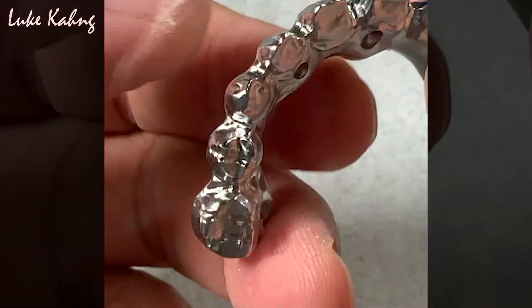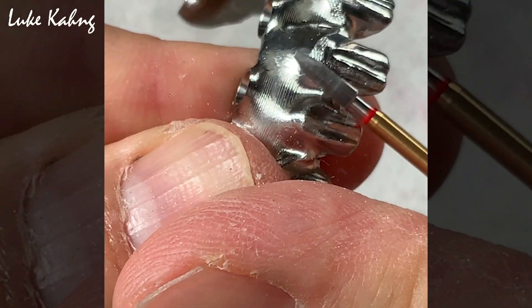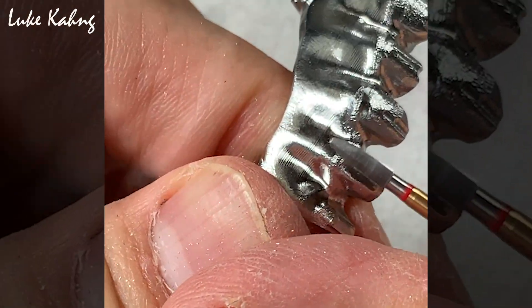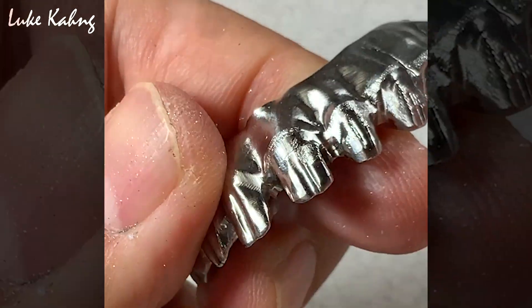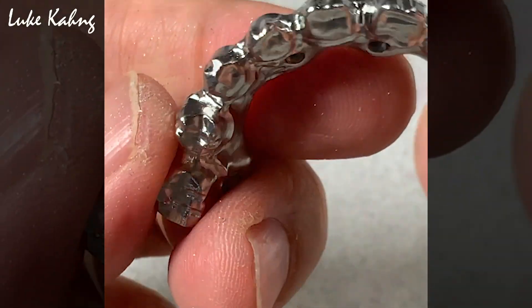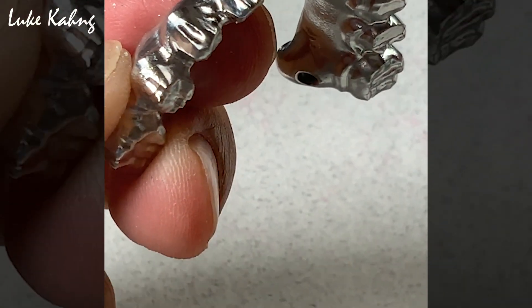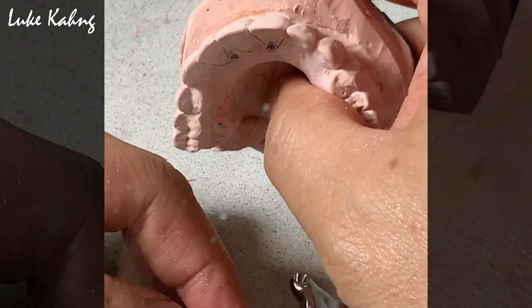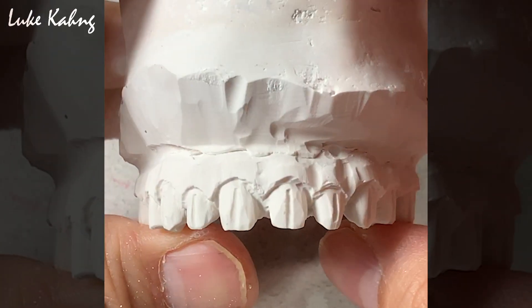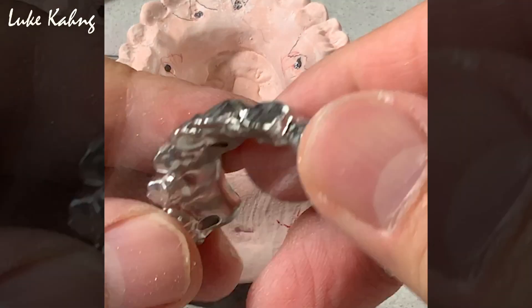Okay, so number one — I just remove it, make it better, turn around. Three, four, five, six — just a little bit. And that's it. Really good preparation in here. And then we prop it and then decrease the width, then make it really sleek.